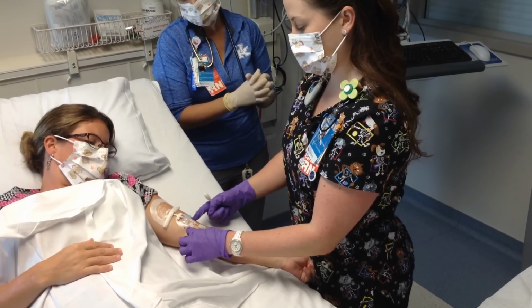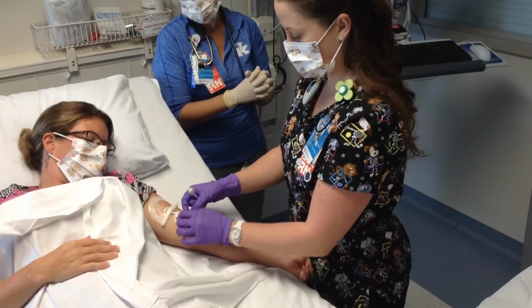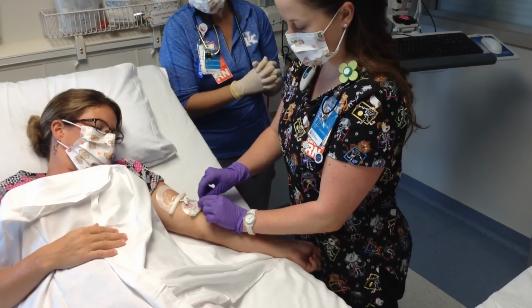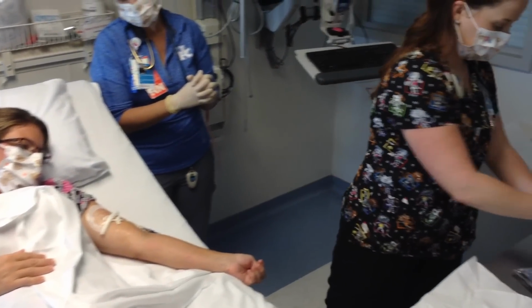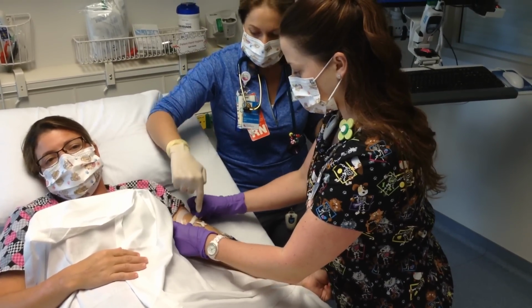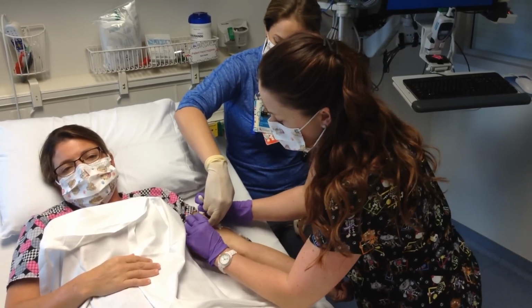Once your dressing is out and your securement is open is when you can remove your securement. Now Kelly's going to be available to be my holder as I peel my dressing off the rest of the way. She'll use her sterile finger to walk up the length of the catheter as the dressing gets removed the rest of the way.